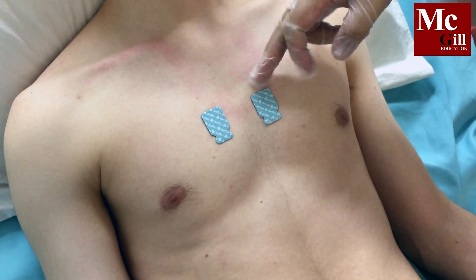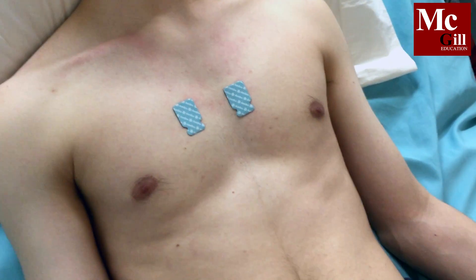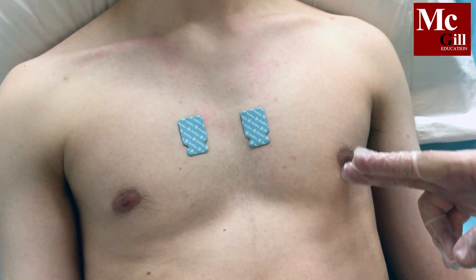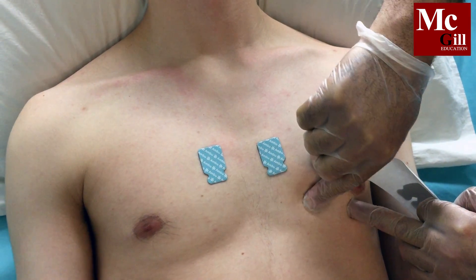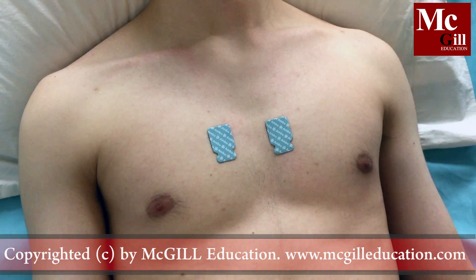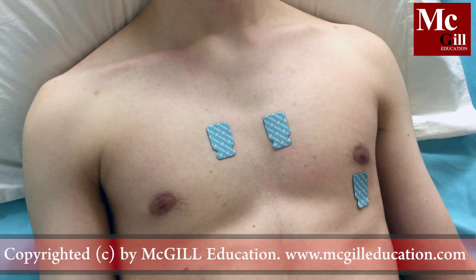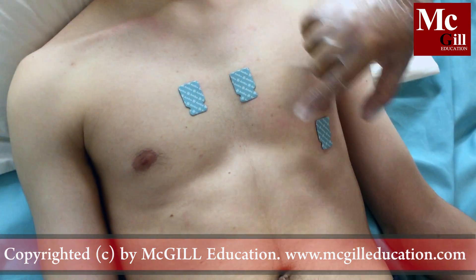Position the V4 electrode in the 5th intercostal space at the mid-clavicular line on the left side. Then position the V3 electrode halfway between V2 and V4.